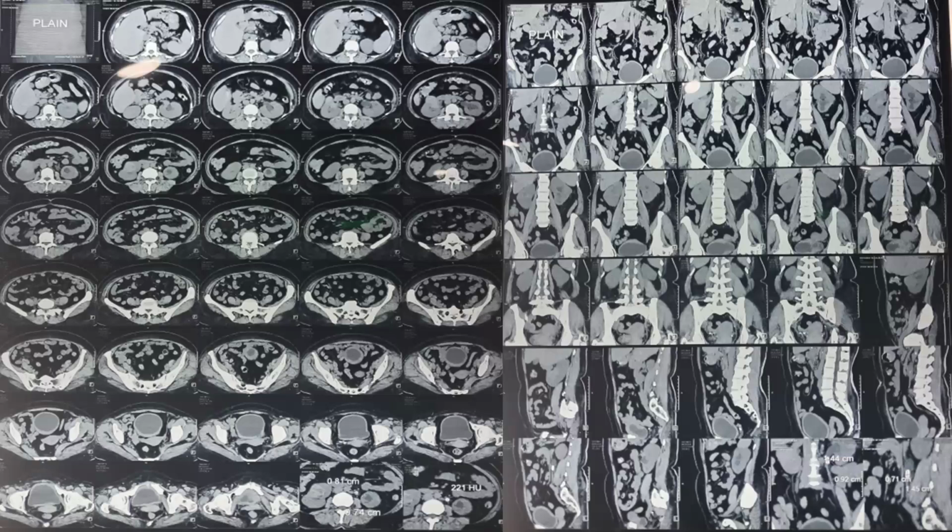The next CT scan is the coronal section. Again, the plain CT scan, I can see the liver, bowel, and the large vessels. And in the left kidney the pelvic system is dilated. I can see that. Then the right kidney. Can you appreciate something that is written in the sonography report?